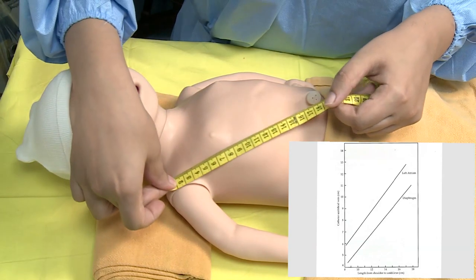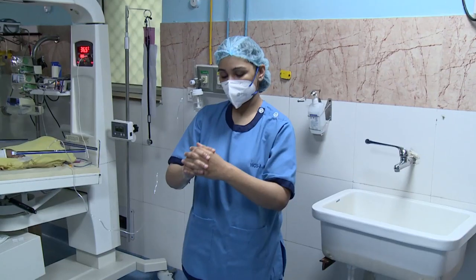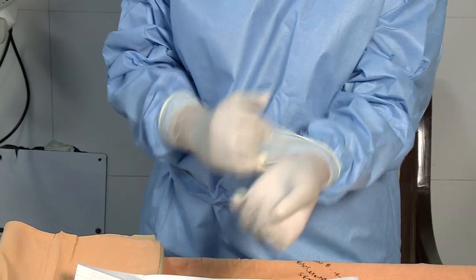Estimate the length of the catheter to be inserted. Wash hands thoroughly. Wear a surgical mask and cap, wear sterile gown, and don sterile gloves.